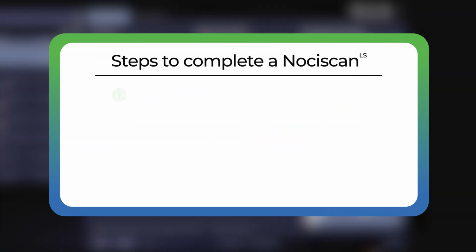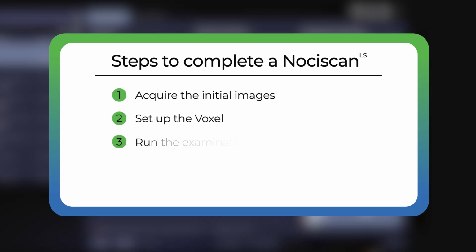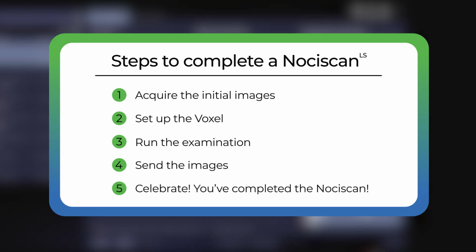We'll now walk through the steps to complete a Nociscan, including image acquisition, setting up the voxel, running the examination, submitting the images, and completing a Nociscan.